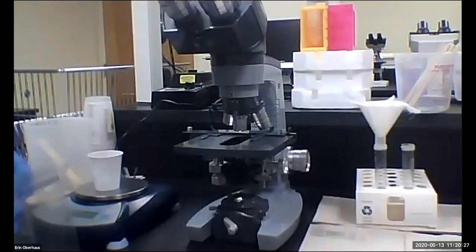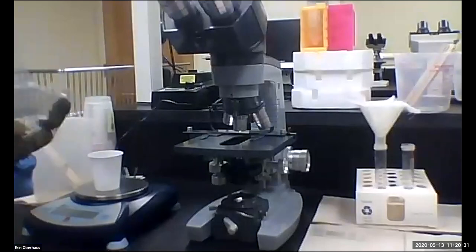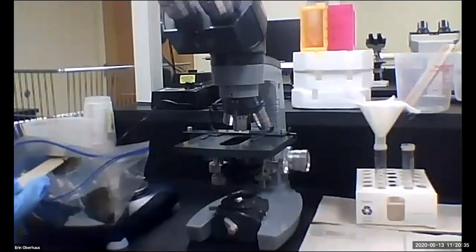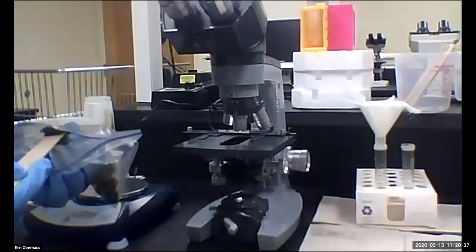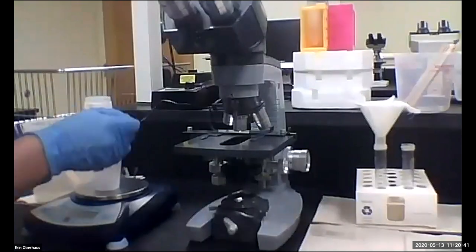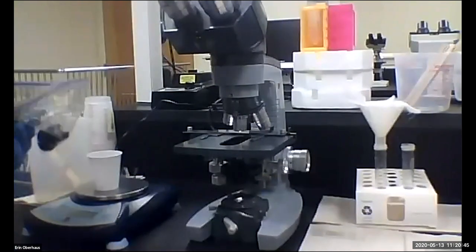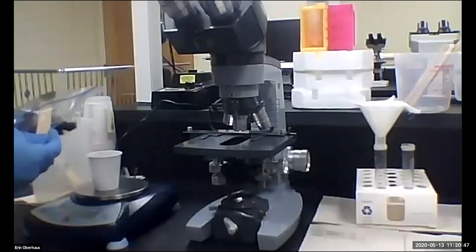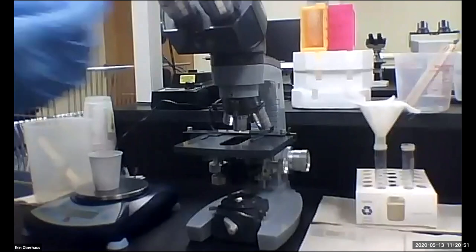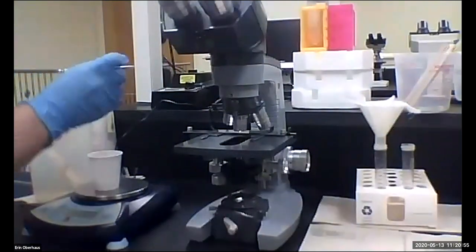So I have my scale at zero, and I typically add about 2 grams. You can add anywhere from maybe 2 to 4 grams. If you're using the McMaster technique, it requires you to add 4 grams of feces to 26 mils of fecal solution. Looky there, perfectly at 2.09, but we'll call that 2.